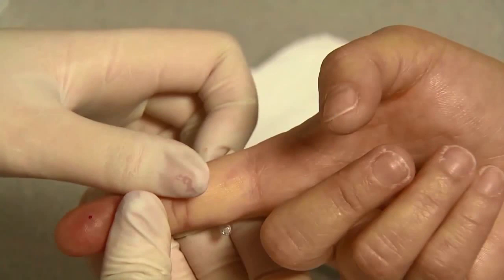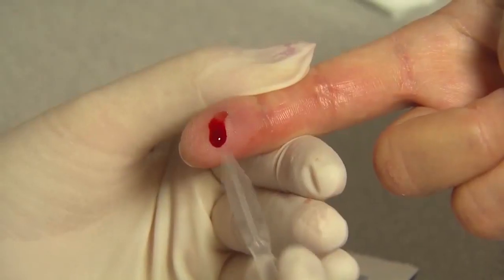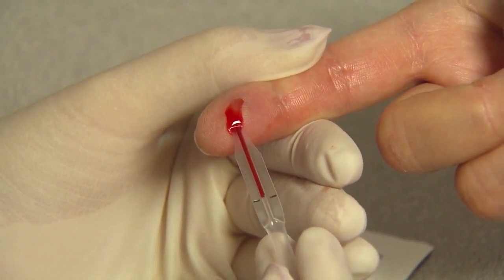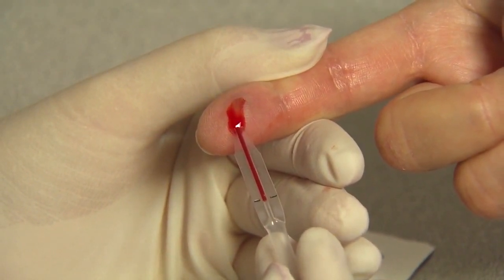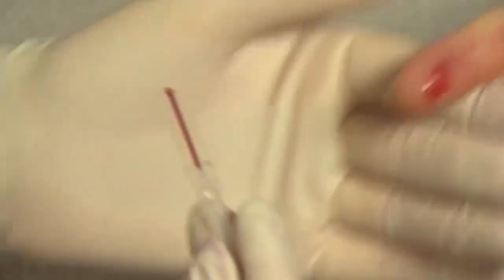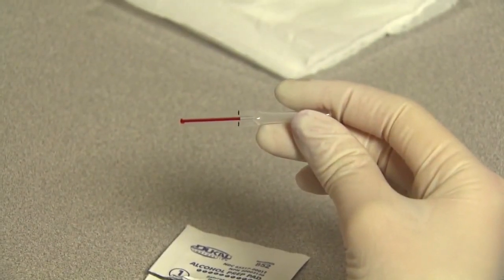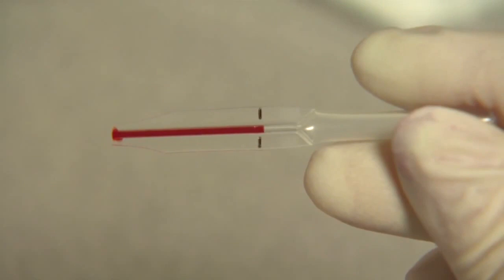Do not apply specimen sample directly on the test device or strip. Collect capillary blood of 10 microliters using a capillary transfer tube or pipette. The capillary transfer tube will fill automatically. It is important to use the capillary transfer tube to collect specimen in order to receive accurate results. Make sure the blood covers the air vent of the tube, or it will be difficult to squeeze the blood out. Never squeeze the capillary transfer tube while sampling.